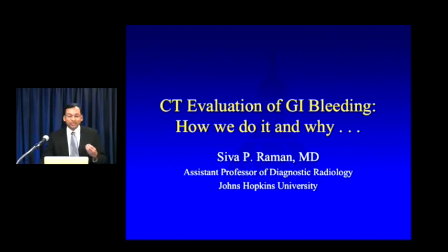about the CT evaluation of GI bleeding. And specifically, we'll talk about why we do these studies, how we do these studies, and how you should go about interpreting these studies in your own practice.